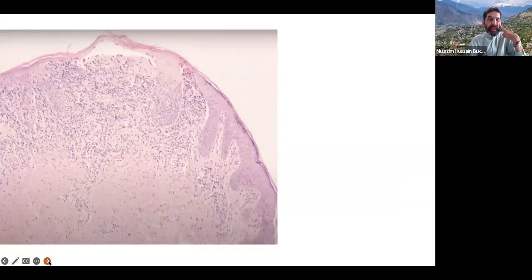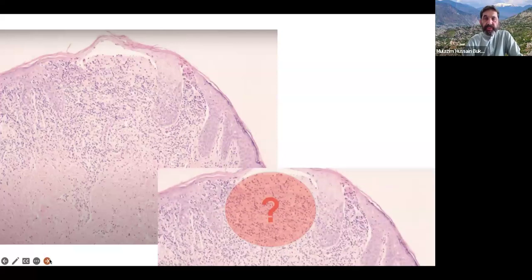So this is again a confusing picture between lichenoid striatus and other conditions. Very important, these are rete ridges, one rete ridge, and this is the second rete ridge. When between the cells they are not making a ball or a sitting chair shape, and it involves the deeper dermis, then it is lichen striatus.